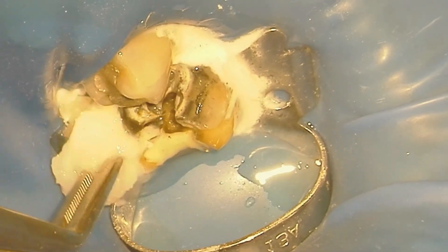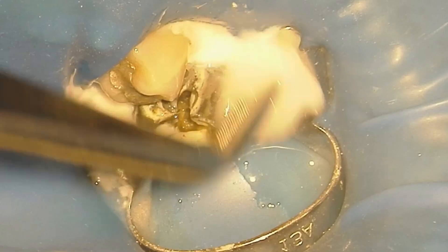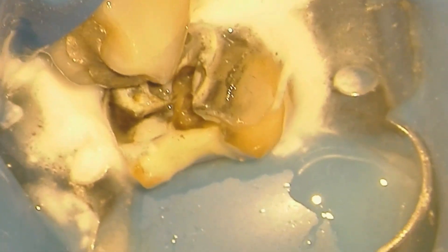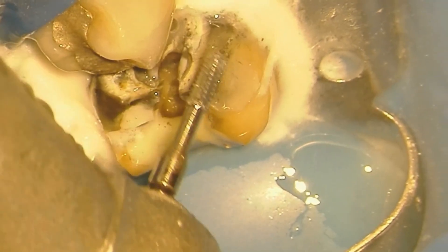We're going to use a wet cotton pellet to smooth it out and set the material. Once that is in place, we are now prepared and ready to start our root canal.